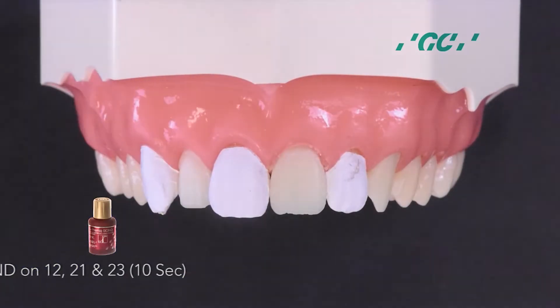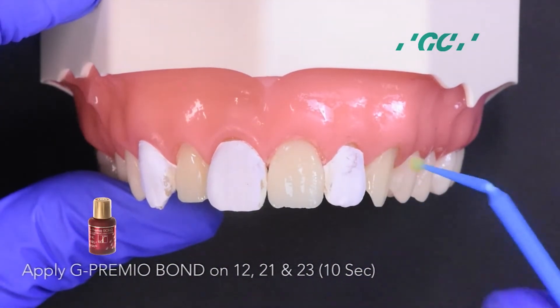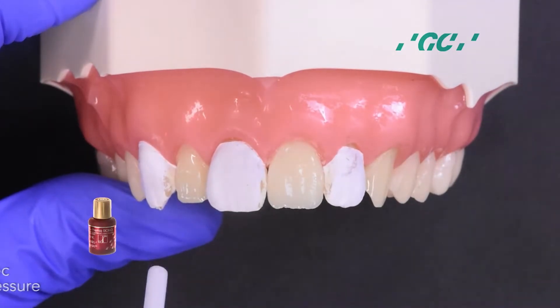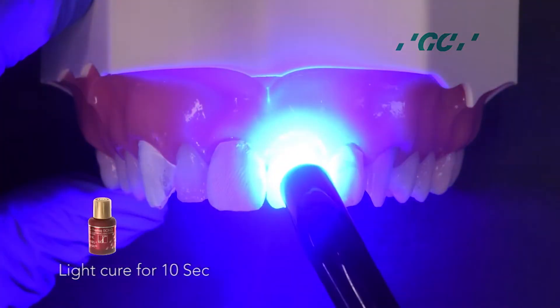Isolate 1-3, 1-1, and 2-2 with plumber's tape. Apply G-Premio Bond on the adjacent teeth. Dry with maximum air pressure for 5 seconds, then light cure for 10 seconds.